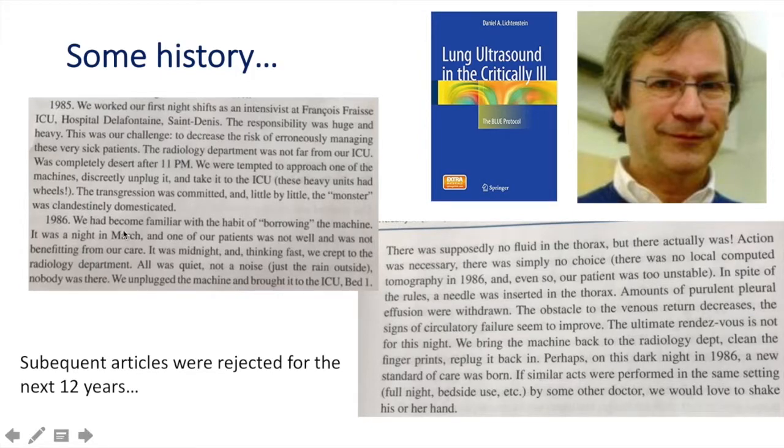It was a night in March, and one of our patients was not well and was not benefiting from our care. It was midnight, and thinking fast, we crept to the radiology department. All was quiet, not a noise. Nobody was there. We unplugged the machine and brought it to the ICU, bed 1. There was supposedly no fluid in the thorax, but actually there was. Action was necessary, there was simply no choice.